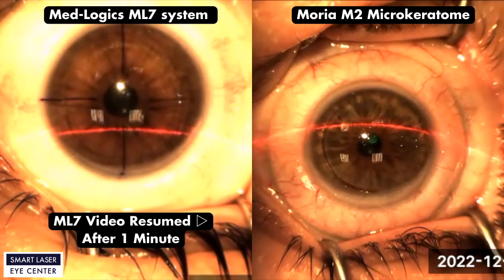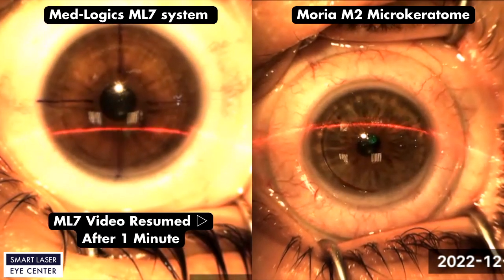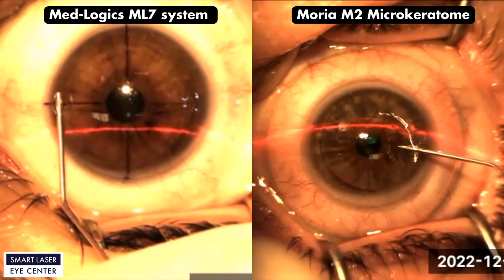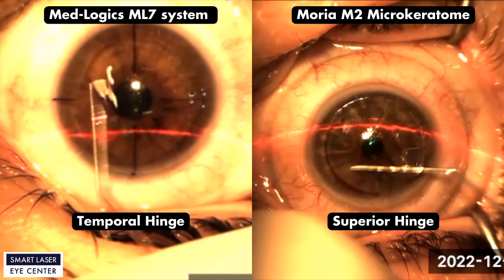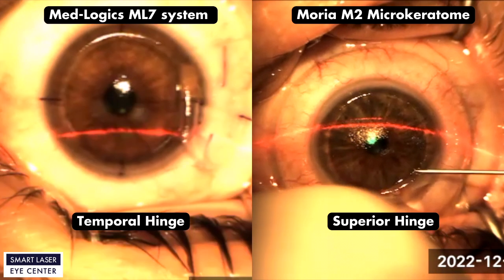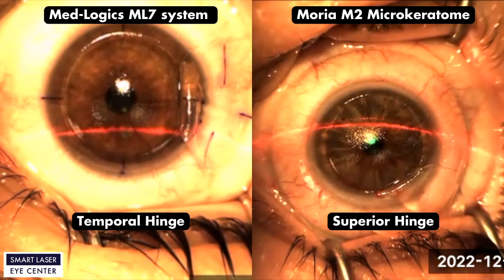Now we can start playing the rest of the ML7 video and let the surgeon finish the laser surgery procedure for both microkeratomes at the same time. ML7 cut temporal hinge and Moria M2 cut superior hinge. The surgeon could lift off both flaps smoothly and easily.